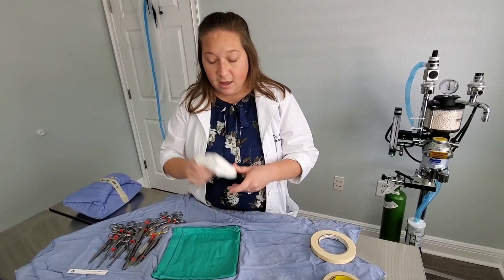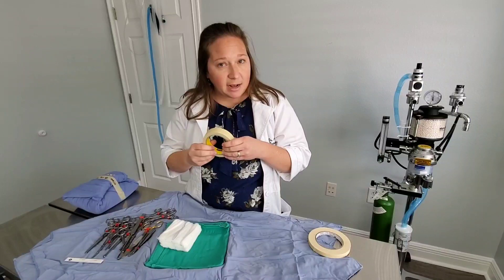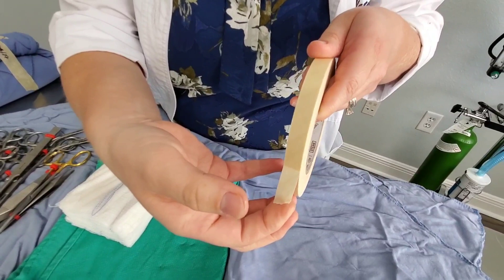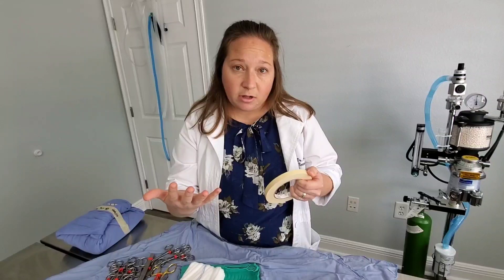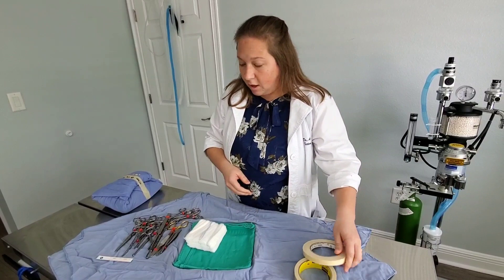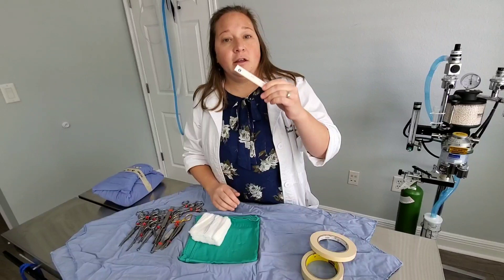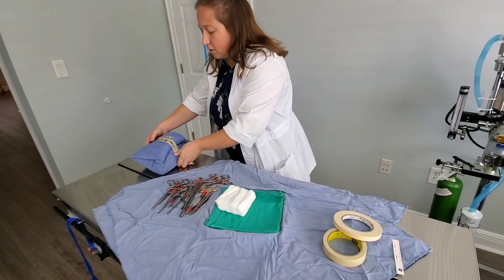We count gauzes before and after surgery, and they are sterile in our packs. When everything is cleaned, dried, and organized, we wrap it up and use regular masking tape on the outside to keep everything together. We also use something called indicator tape — there are little lines on it, and after autoclaving it turns black, showing the pack is sterile. The last thing we add is an okay strip, a final marker near the instruments confirming they ran through the sterilization process.